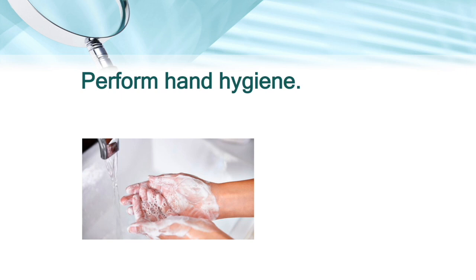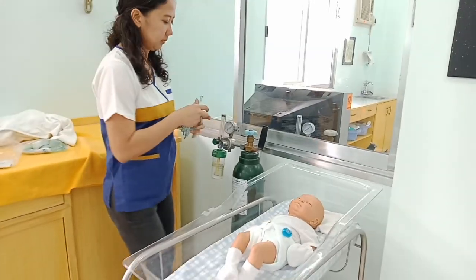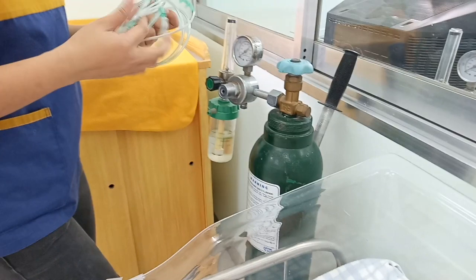Perform hand hygiene. It reduces the transfer of microorganisms. Attach oxygen delivery device like cannula or mask to oxygen tubing. Check if there is oxygen inside the tank.